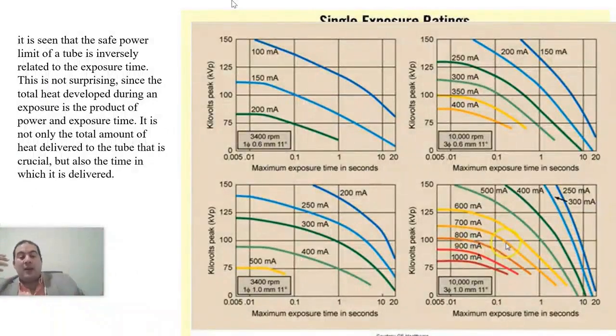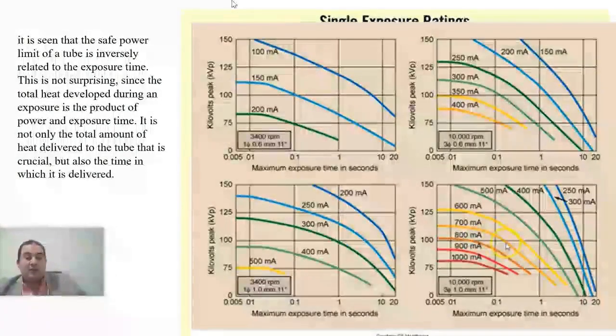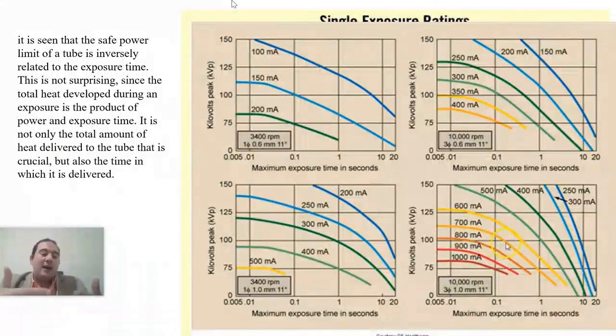For example, some machines can take around 30 to 40 seconds. Especially with a Toshiba device, those 40 seconds are a lot, because to achieve, for instance, 250 milliampere with 120 kilovolt in those 40 seconds, the machine may not accept it and will tell you to reduce the parameters. You won't discover this until after you have actually purchased the machine.